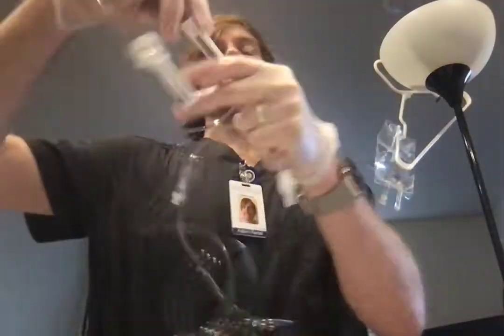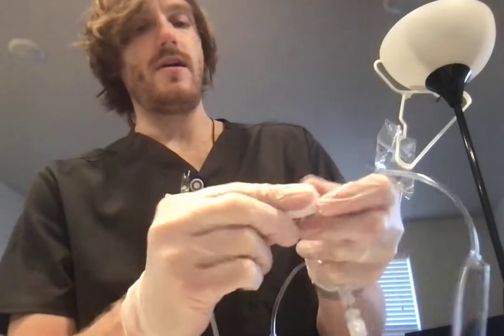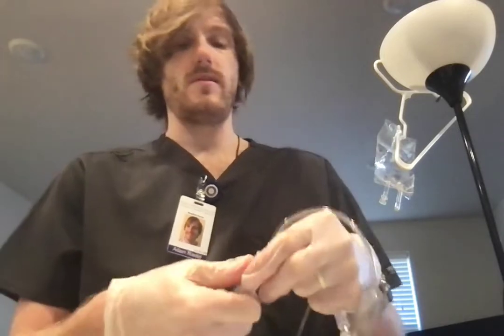But the roller clamp is going to dictate how fast or how slow your flow rate is going to be, and it's in the fully on position right here. And then when you roll it, it squishes, clinching the tubing, and that would be fully off, all the way to the bottom.